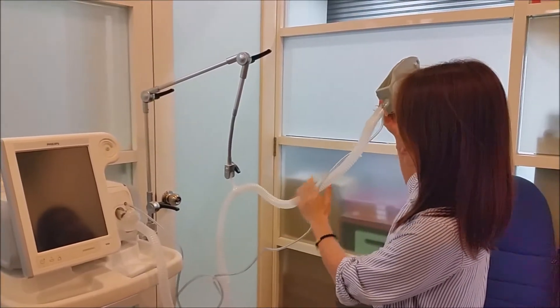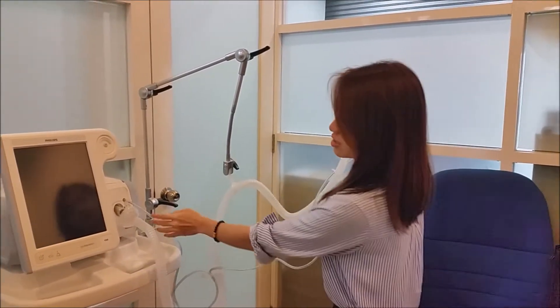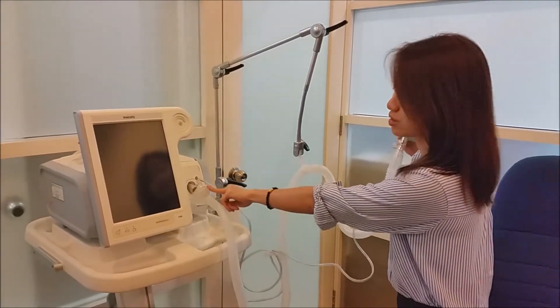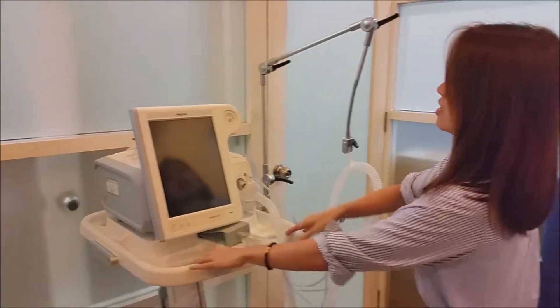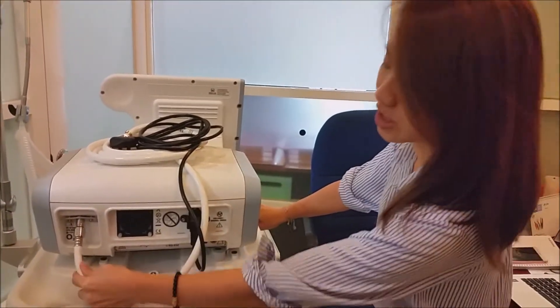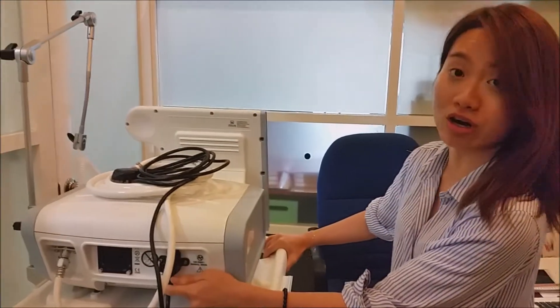Over here, as you can see, this is the circuit. This is the proximal pressure line. This is the bacterial filter. And then, moving to the back, you can see that this is the oxygen hose over here, as well as the power cord.